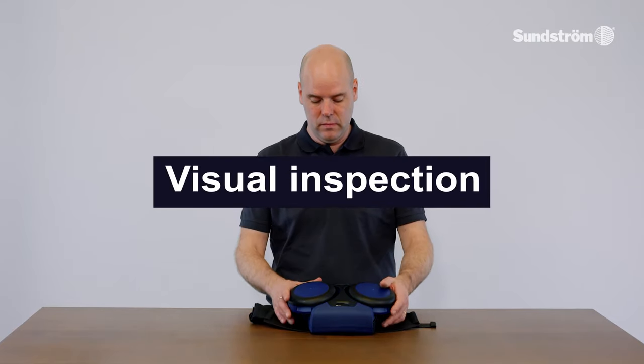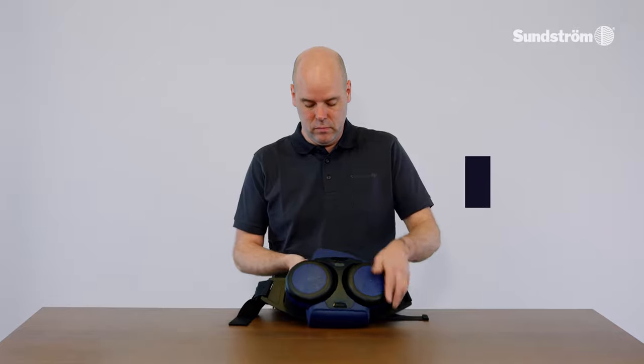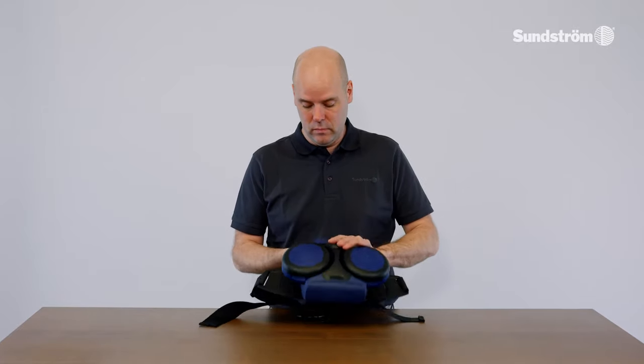Visual inspection. Check that the fan unit is complete, correctly mounted, thoroughly cleaned and undamaged.